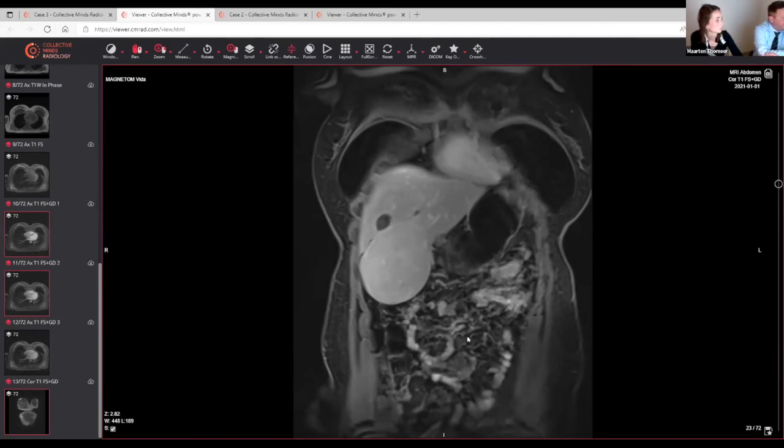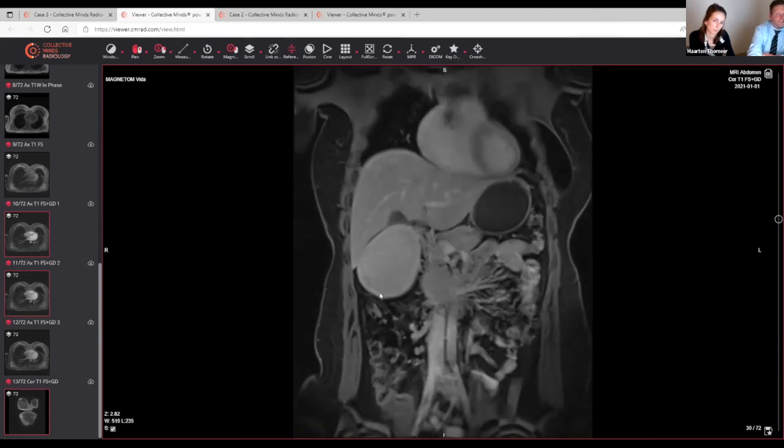But we also did a molecular diagnostic. We did next generation sequencing for exon mutation in the largest part of the tumor. There we found no exon mutation. If you see an exon mutation, it can be exon 3, exon 7 or 8, then it's a beta-catenin adenoma, which is pre-malignant. So there was no reason for malignancy or pre-malignancy in this case. But for the first time, we tried to look more specifically at the region here below. We did a molecular diagnostic in this part, and surprisingly, we found an exon 3 mutation in this part of the adenoma.